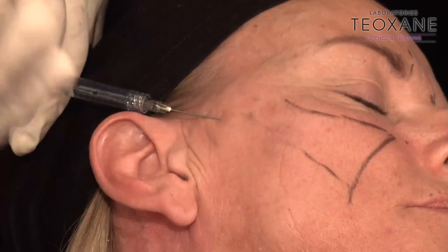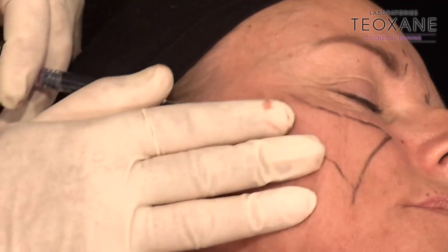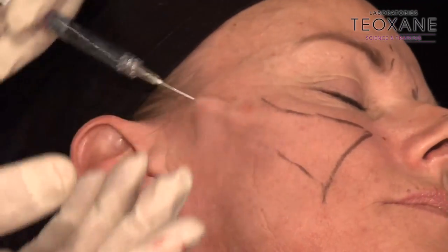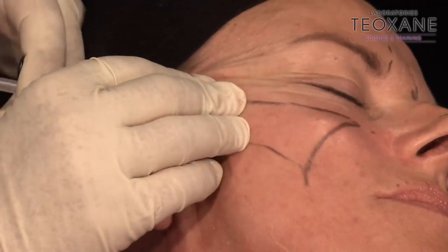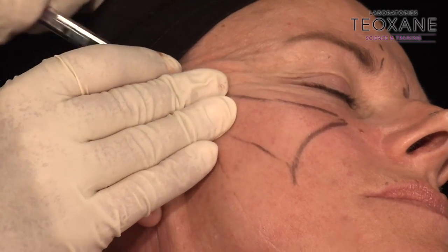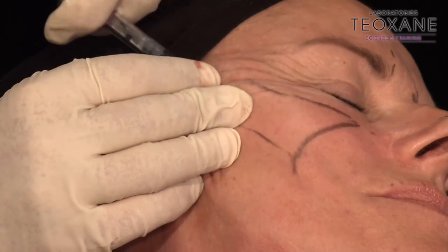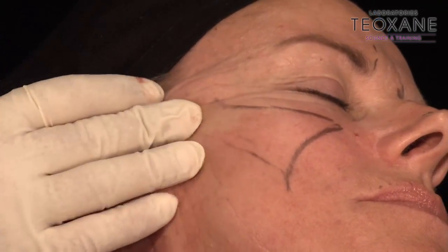Look at that. Look at this hand. My right hand, because I'm left-handed. My right hand is working. My right hand is pulling. Okay, it's pulling. This is very important. You don't work with one hand. You work with two hands. So this one is pulling up. Show me the tension. Show me the direction. Show me where I should go. Show me where I should put my filler. Okay, with this hand, I know exactly where I am, what I have to do, and what I'm doing. Up, finished, quick.